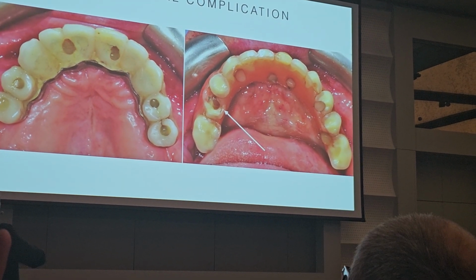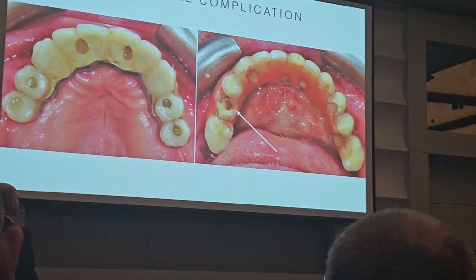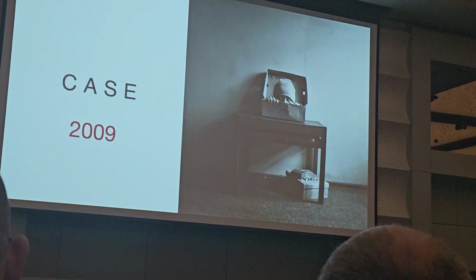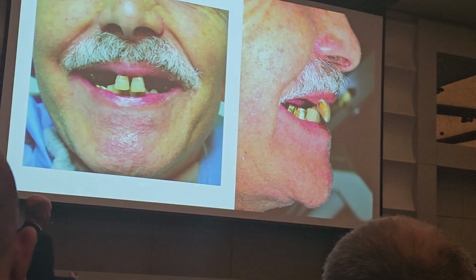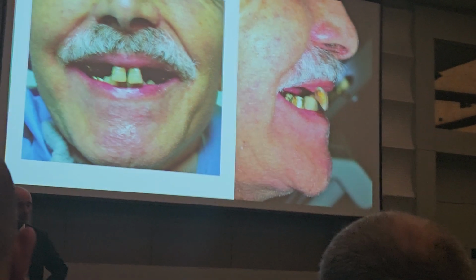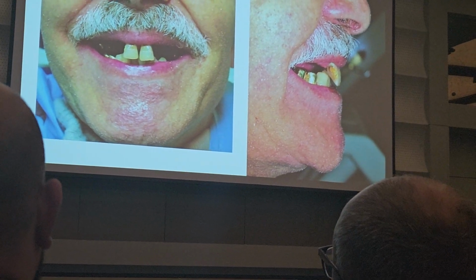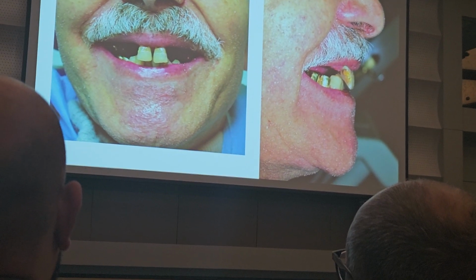Of course, there were a lot of mechanical complications in this case. You can see the wear of the prosthesis. So, another case. At that time, I was not using any guided surgery, any mock-up, any wax-up. I just placed implants freehand.